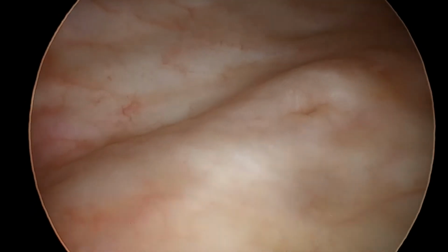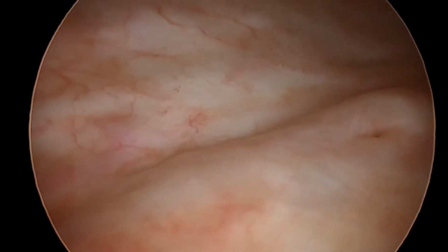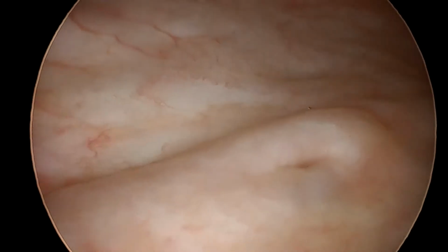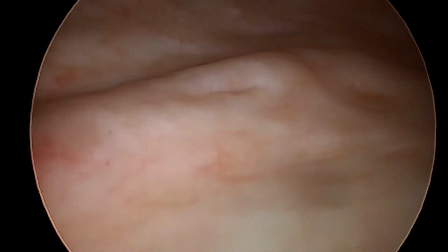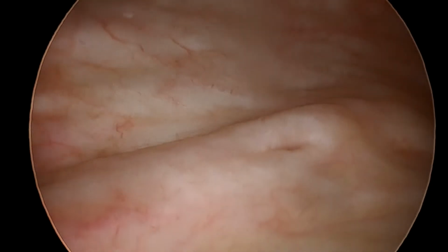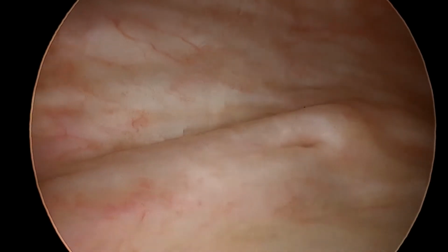We are planning to observe if there is any damage which may have inadvertently occurred to the ureters during the laparoscopic hysterectomy. On your screen, you see the opening of the left ureter and jets of urine are coming out of it.